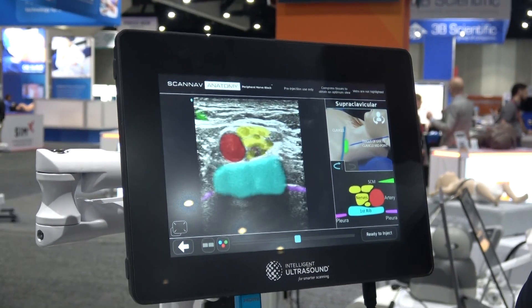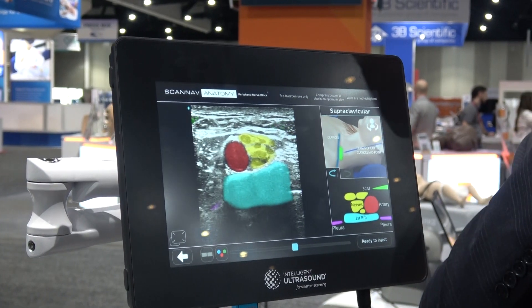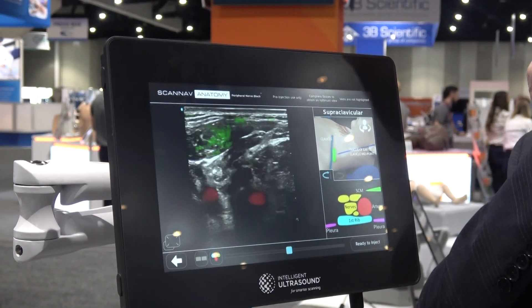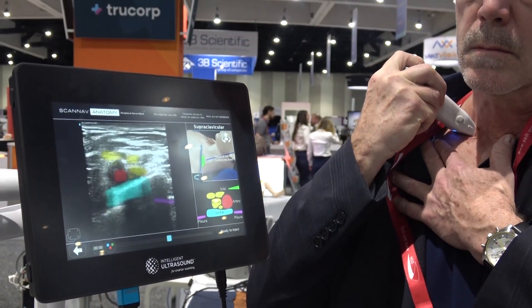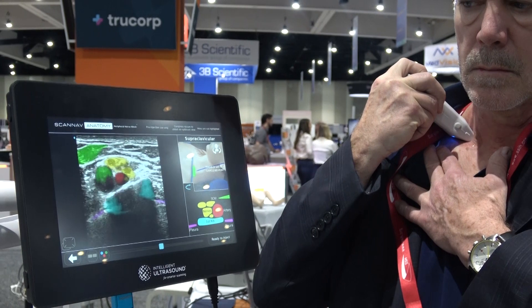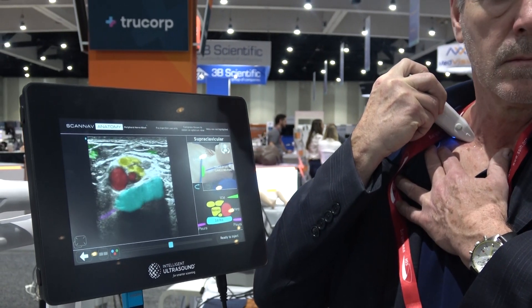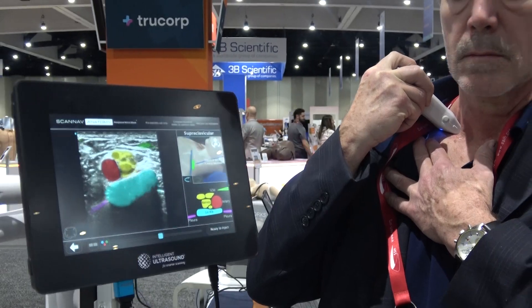This system takes him from the classroom into the clinic — it allows him to learn and then consolidate those skills, and his trainer and supervisor can help him in that clinical situation much more easily than without the system. This is our classroom-to-clinic philosophy.